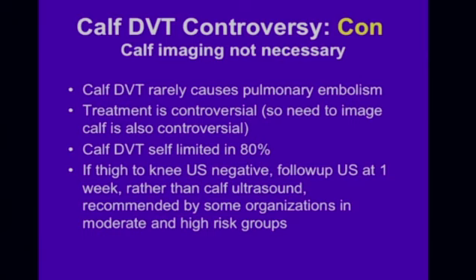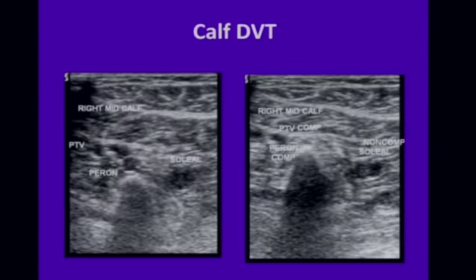So we do that by recommending a follow-up ultrasound at 1 week for those with a negative thigh and knee ultrasound and those with calf DVT. The patients whose calf you don't look at may be at high risk and shouldn't be ignored, particularly if there are continuing symptoms.